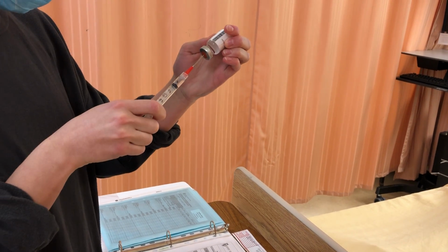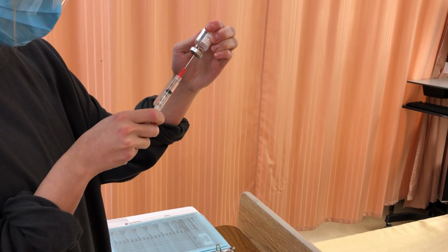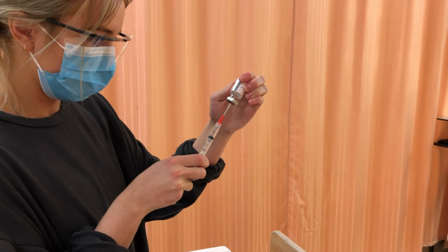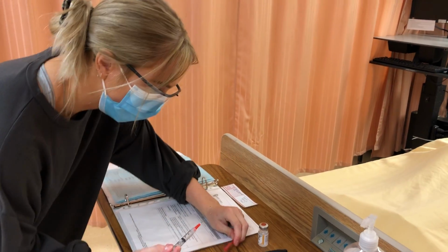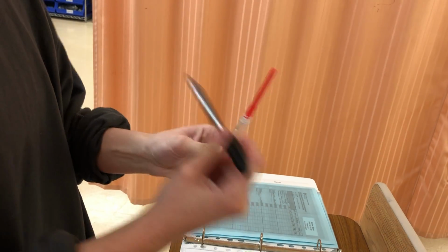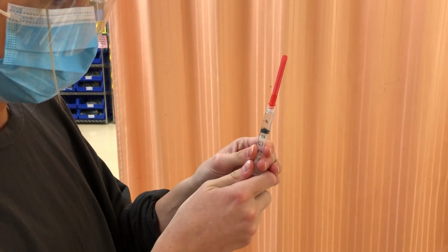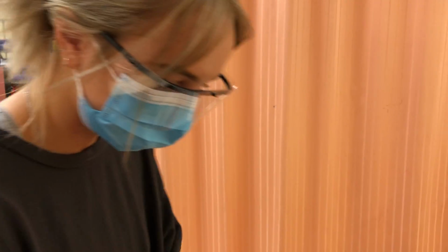And then I'll draw back exactly 1 ml. Okay, so we have our 1 ml. I'll recap. Make sure we have no bubbles, and making sure we have that exact 1 ml.